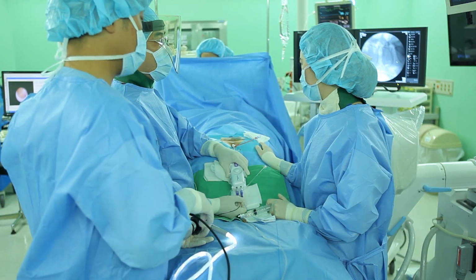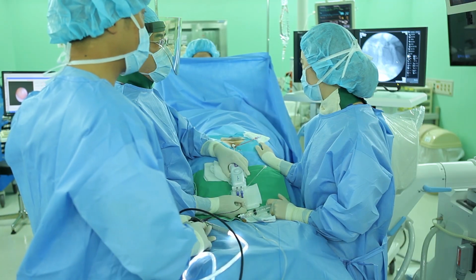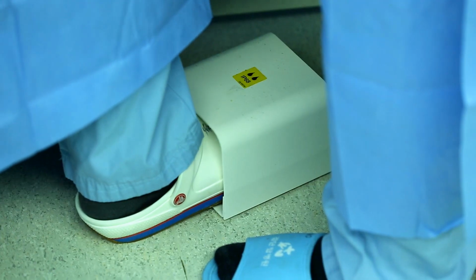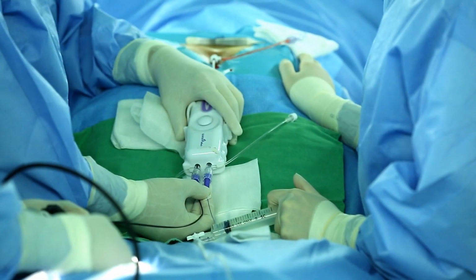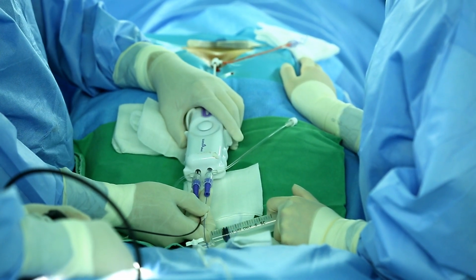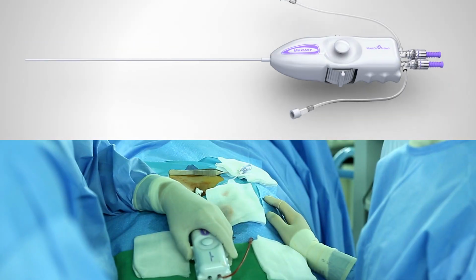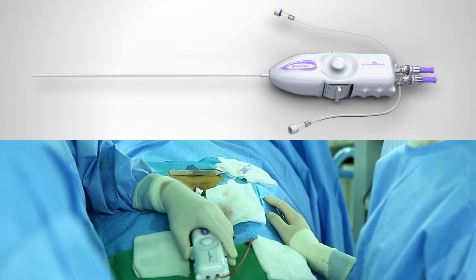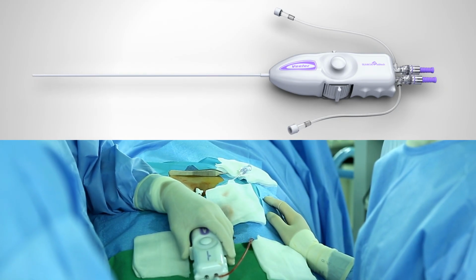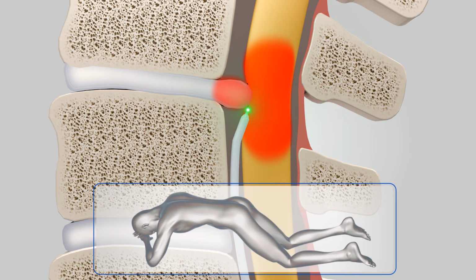Laser treatment is composed of stimulating or testing, and shooting or firing. Explain stimulation first. The stimulation is required to make sure of firing the laser safely. Especially for a new doctor for SELD, safety is the most important point. After you reach the targeting point, you need to double confirm the disc area by steering the catheter to the left and right.